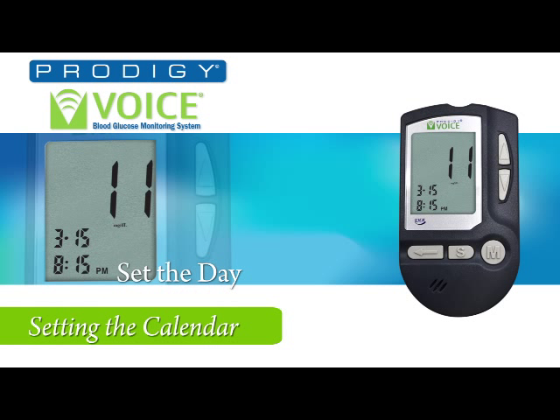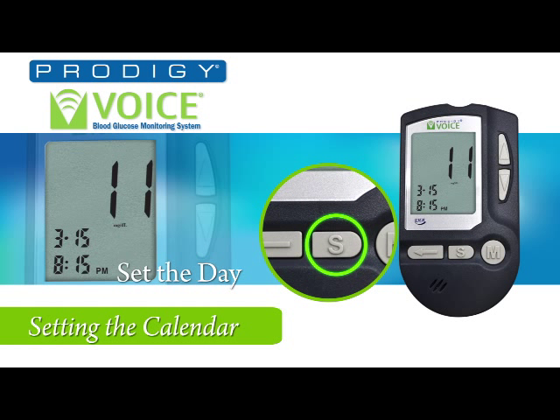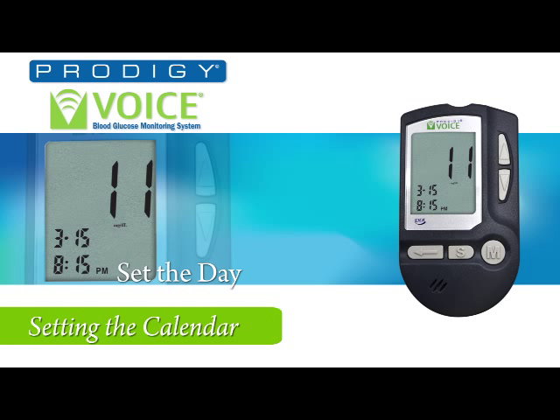Now we set the date. Press the set button. You will hear: 'The date, 15.' Press the up or down buttons to set the date — 16, 17. Remember that changing the date may affect the test result averages.